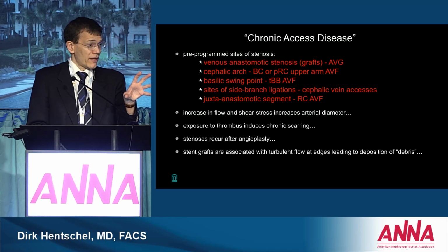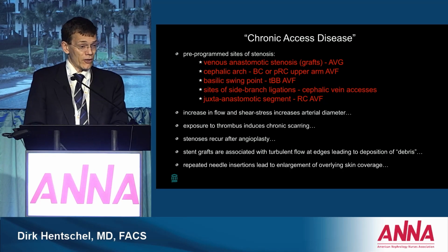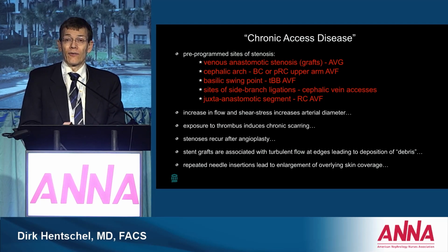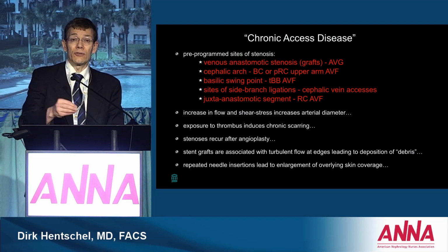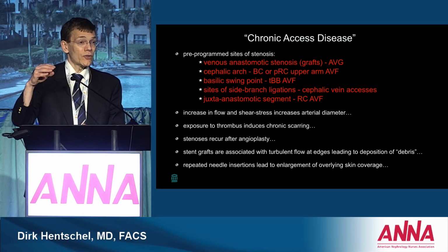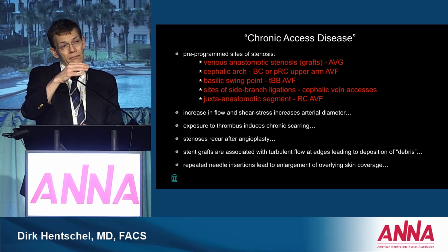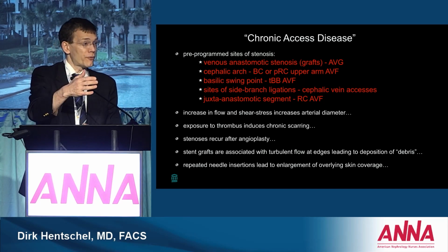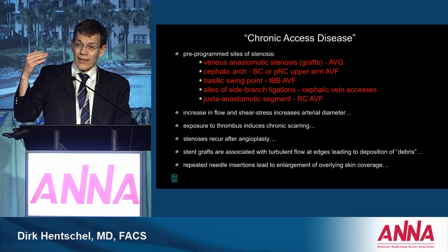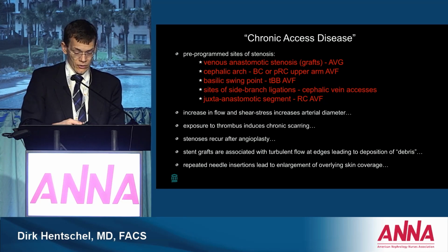Stent grafts are foreign material, I mentioned that. They can have narrowing on the inside just by deposition of biological material. And then needle insertions by themselves can carry fibrocytes into grafts and cause stenosis inside grafts. They can also, if they're placed in the same area all the time in a fistula, cause a narrowing at the site where the needle frequently ends, similar to a bunion on a foot. So you can angiographically see that the site of stenosis correlates with frequent use patterns of needle insertion.